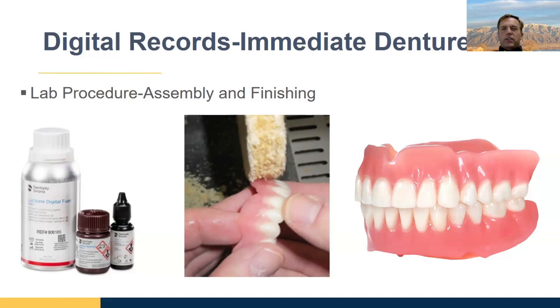The question is, are printed dentures, due to shrinkage post-process, more accurate than milled dentures? No, I think if you are getting down to microns, a milled denture, as long as the mill can access it, is going to be a little more accurate than a printed denture, because milling tends to be a little more accurate at a micron level. But the main advantage to printing is that milling is really hard.